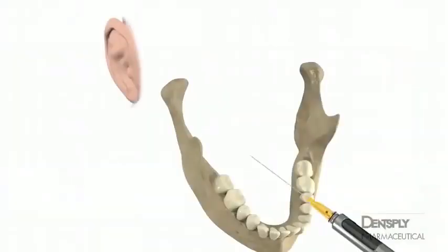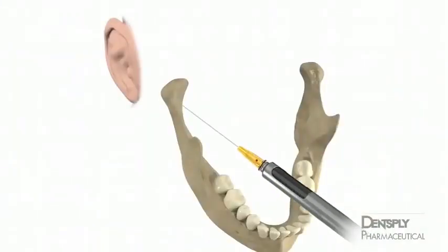The needle is advanced in this plane just medial to the deep tendon of the temporalis muscle and through loose fatty connective tissue until it strikes the lateral neck of the condyle. Perhaps the most challenging aspect of this injection is determining the proper angulation of the syringe within the plane of insertion. According to Gowgates, the lateral flare of the tragus parallels the proper orientation of the syringe.